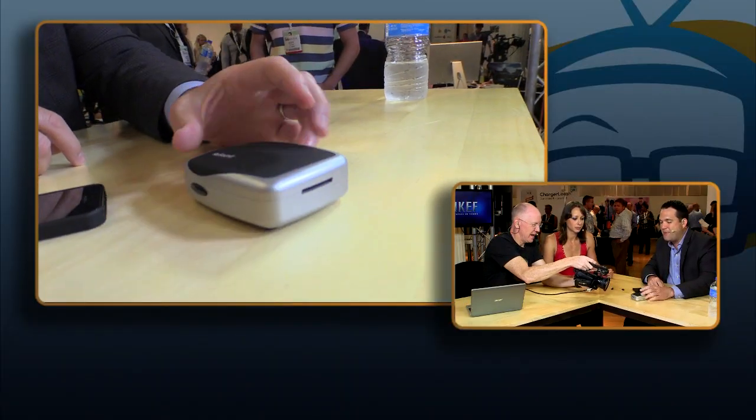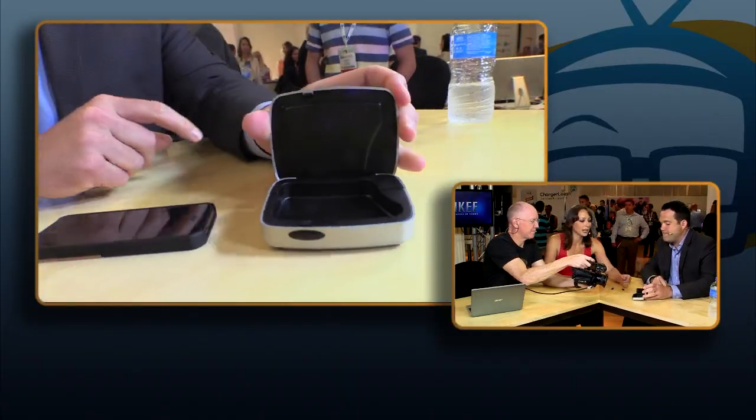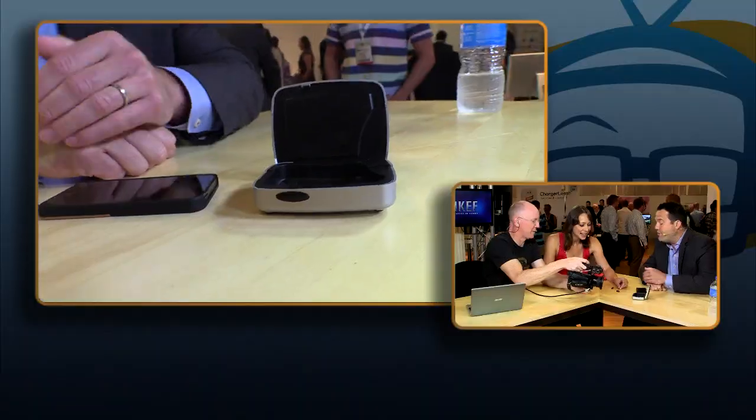Also, it looks like, is that a little case for it or something? Yeah, that's just the case they come in. So you can store them in there. Little example there. Keep them safe. These are tiny. You give them a little room. You don't want to squish them. They've gotta have breathing room. And for the most part, if you wear them, you don't need the case. You wear them all day, then you sit them there when you go to bed at night.